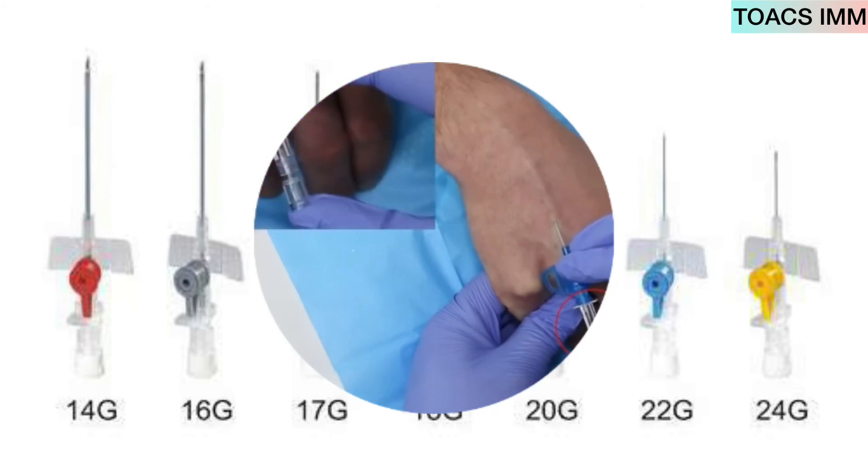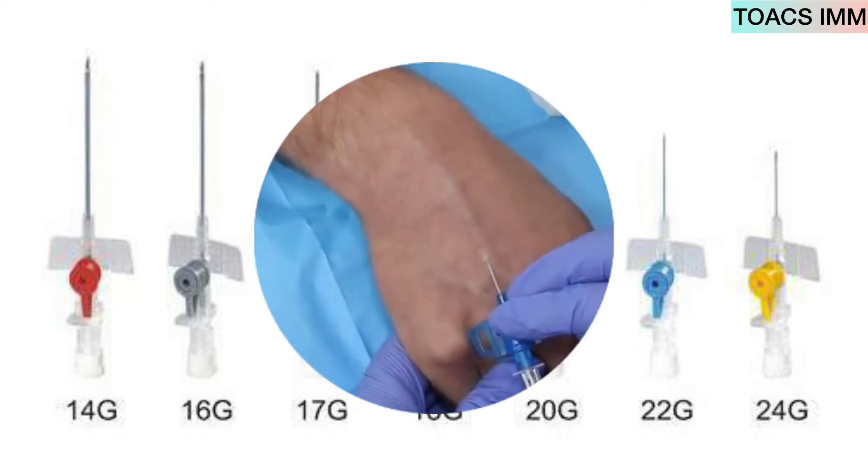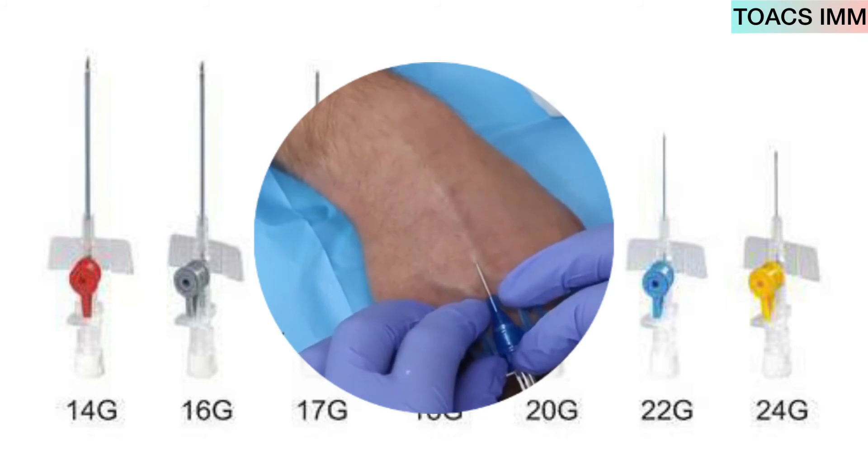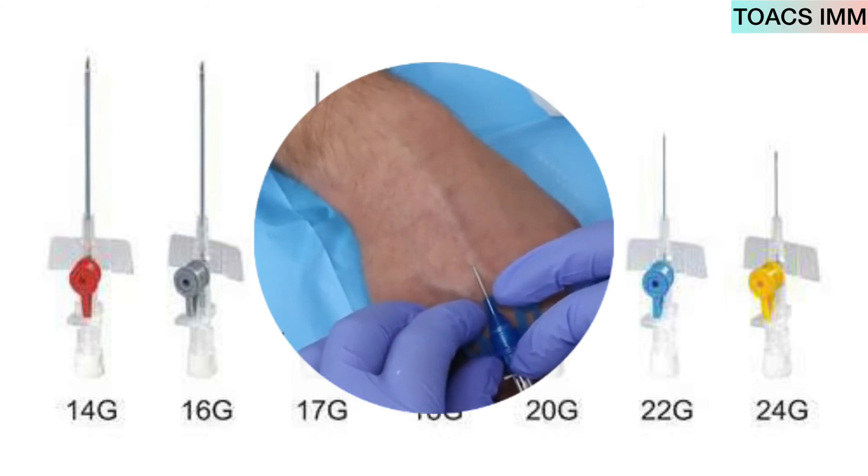Insert the cannula at 10 to 30 degrees. Observe the flashback of blood, then withdraw the needle and advance the cannula into the vein.